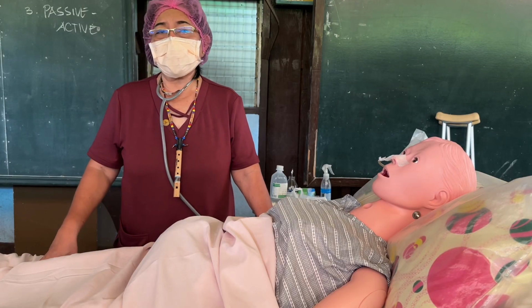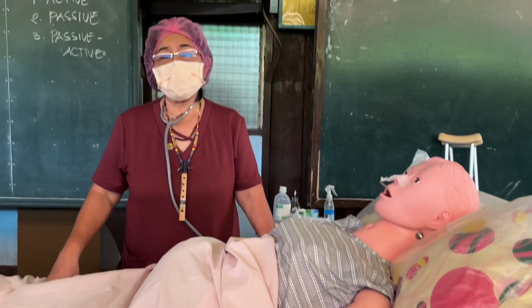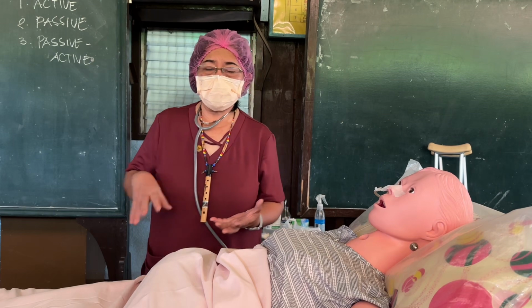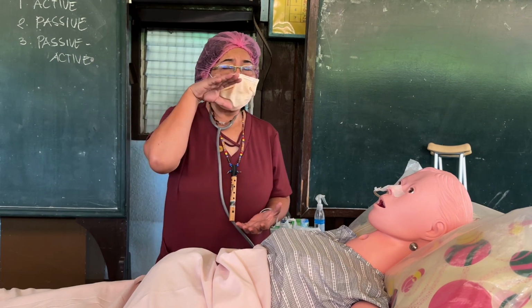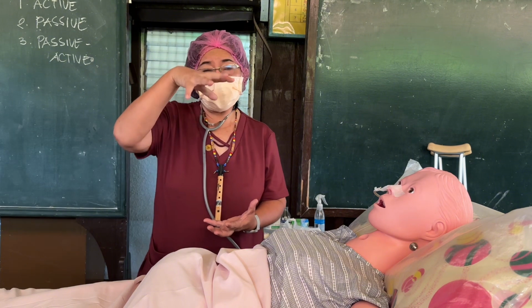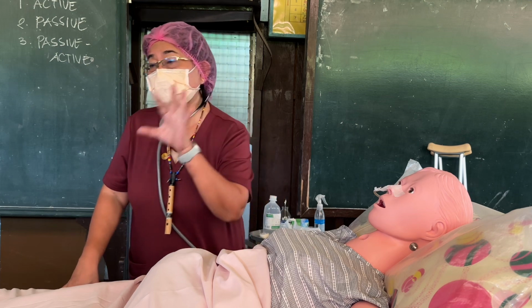Okay, class. Depending on whether your patient is still hospitalized, you have to get the authorized feed from the dietary division. So expected, once from the dietary division, even at home, you prepare the patient's intake within 24 hours, measured to be consumed within 24 hours, and kept in the chiller.